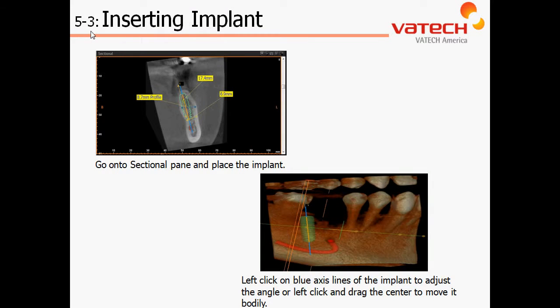Chapter 5, Section 3: Inserting Our Virtual Implant. We'll have the ability to place our virtual implant using either the grayscale view, such as our sectional view, as well as placing and assessing the orientation of our implant within our 3D rendering, as shown here in the bottom right-hand corner.